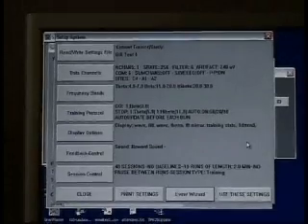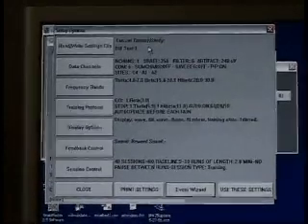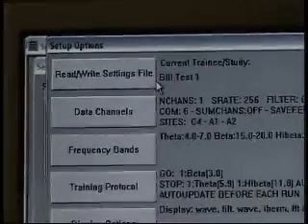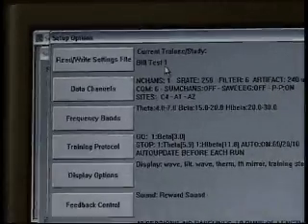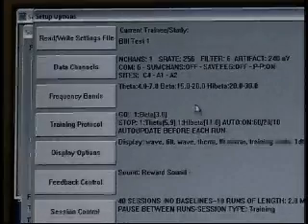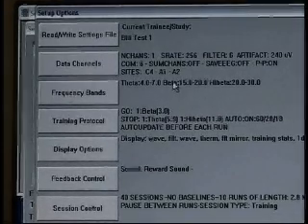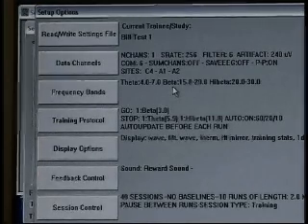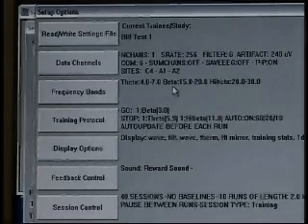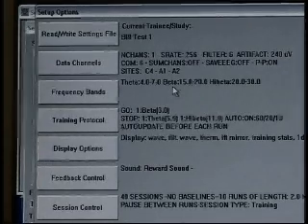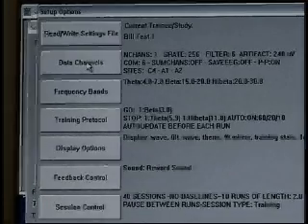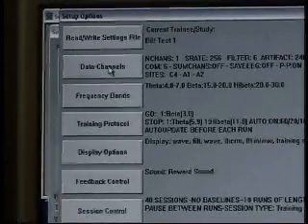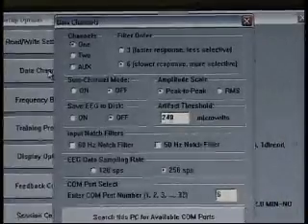We hit OK and we notice a new box appearing called Setup Options. The current trainee study is 'bill test 1', which is the folder we just created, and we see that the settings from alert have now been dumped in there. We're going to go through each of these buttons individually to show you the decisions that you can either leave as the default from the settings file, or change to your liking. We start with Data Channels — we'll come back to Read/Write Settings File later, but Data Channels is our first place to start.